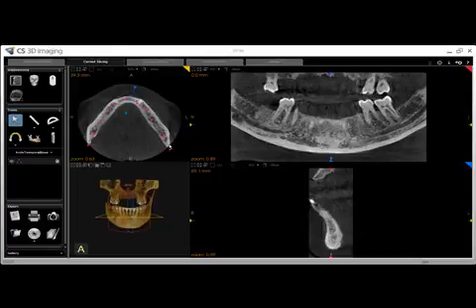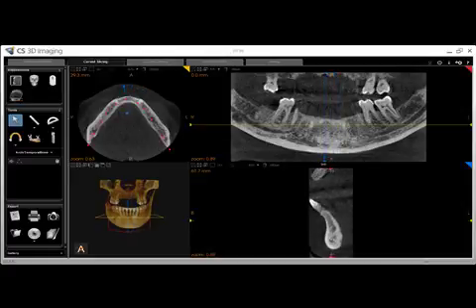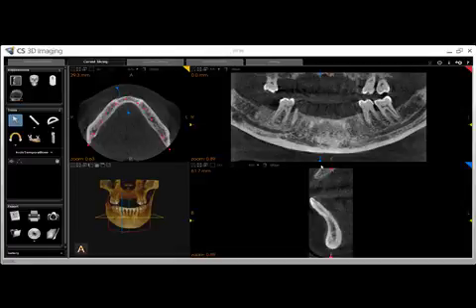Once your curve is drawn, your panoramic and transaxial views will appear on the right. Keep in mind that the transaxial view is a cross-sectional slice along the long axis of the blue line in the panoramic image.